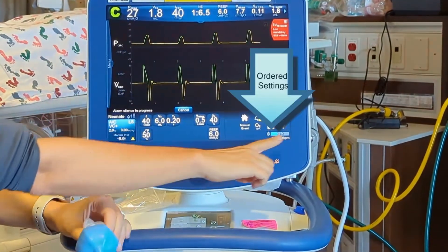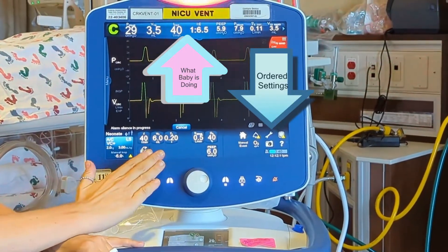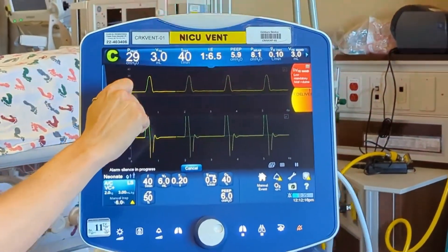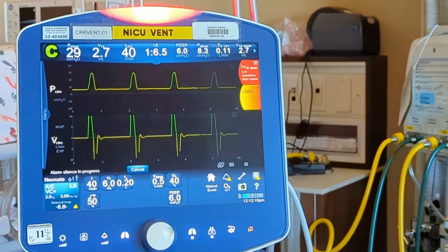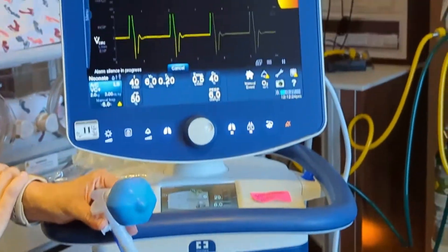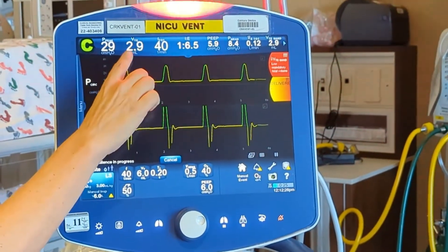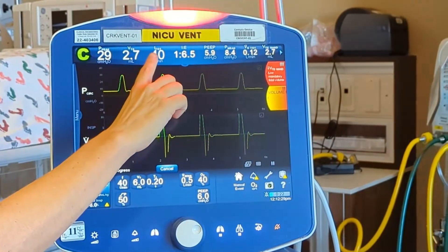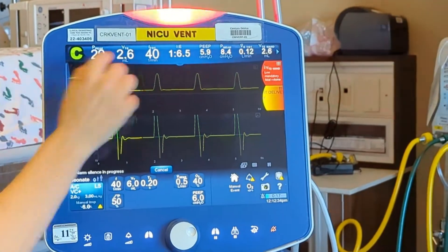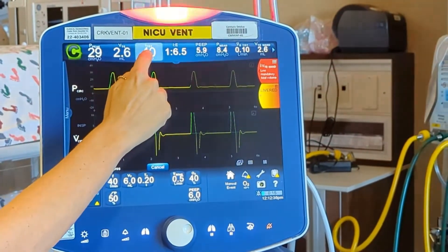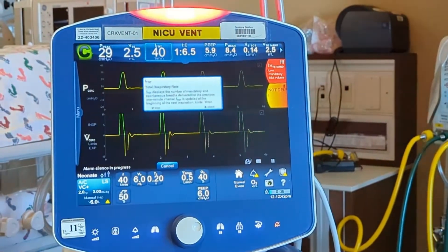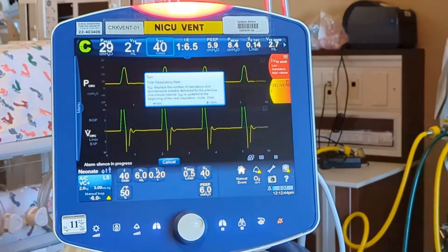Everything shown here is what we have set; this section shows everything the baby is actually doing. We start with peak pressure — this is where we're worried about too much pressure, where the baby could possibly have a pneumo, need suctioning, or is coughing. We also have our minute ventilation. F-TOT is total frequency — that's just the respiratory rate. If you're not sure what any of these are, you can press them and it will tell you.